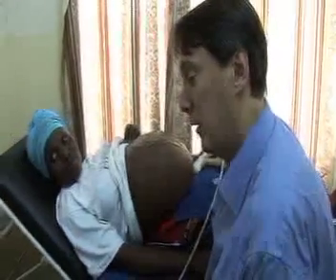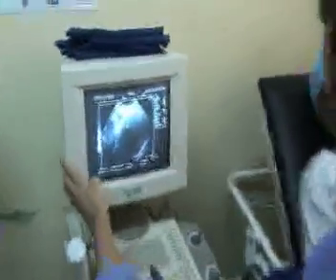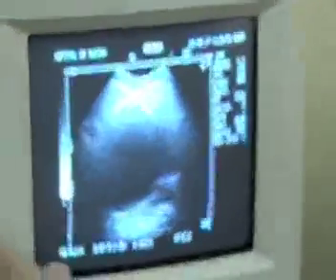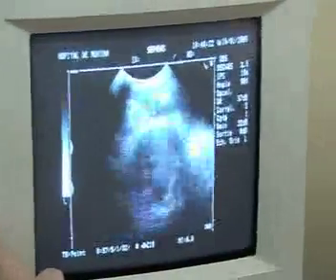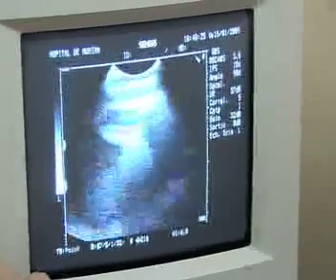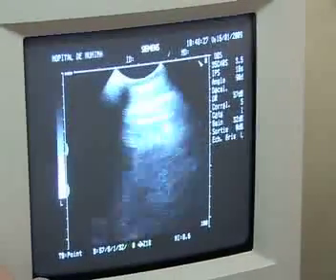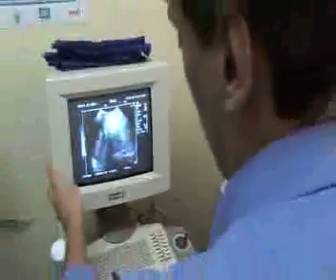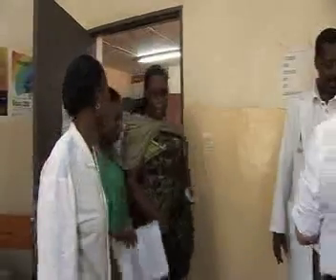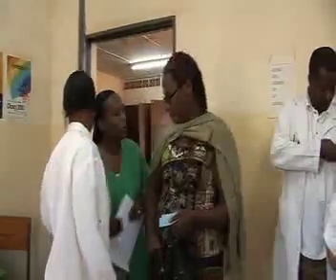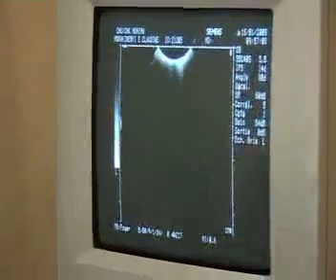So it's a singleton pregnancy. The head of the baby is in the right position, down in the pelvis. She seems to be quite advanced — the maternal instinct was that she was nearly about to give birth, and indeed she is not far from her due date. Remember in transverse, I said this little dot should be facing you.